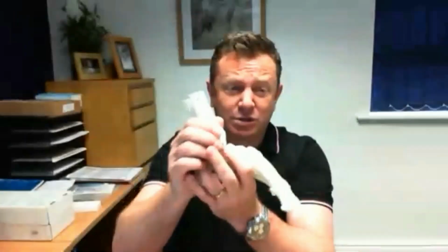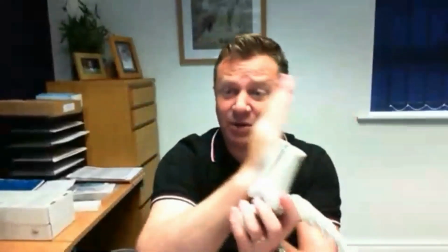For those people, the alignment of the heel doesn't matter. We want an orthosis that fits closely, and we want to reduce axial compression load. We need to think about kinematics so that we don't adversely affect the knee and the hip when they're moving, but our primary design is force, and then kinematics comes second.